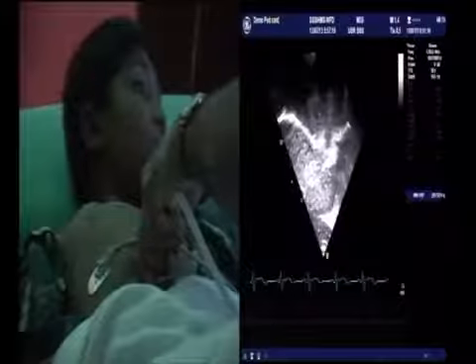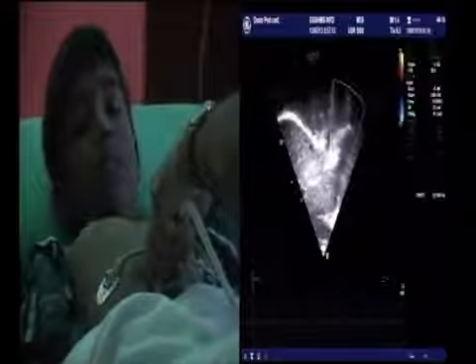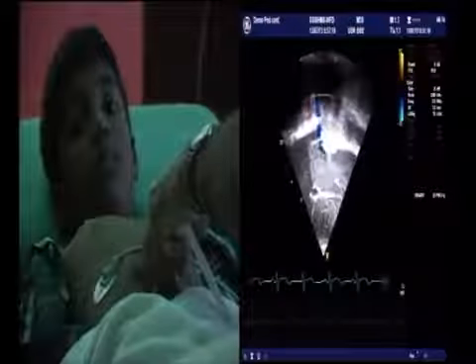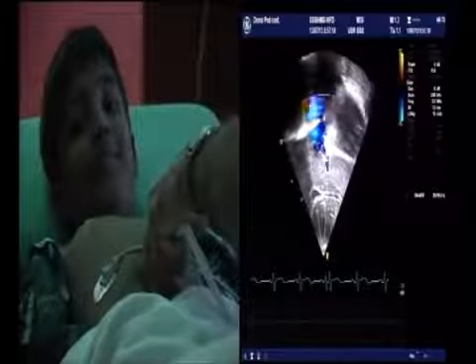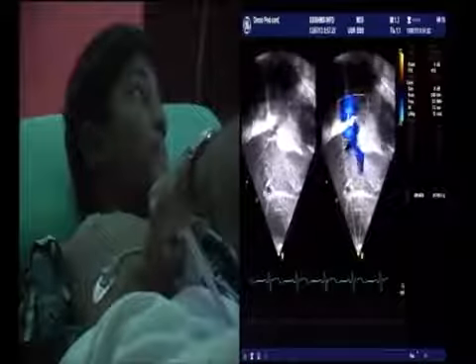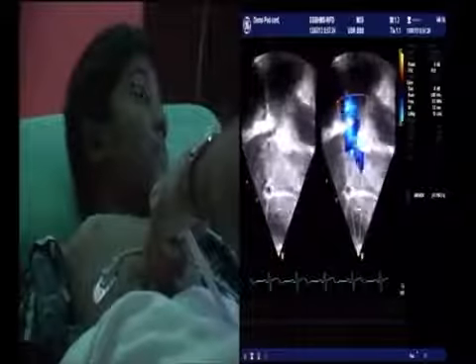So these are the hepatic veins, as you can see. Just confirm it by color also, and look at where it opens, and you can nicely see it opening. Now you can clearly see the opening as well. This is one good thing you can do. You put a color compare. You can see both the structures.